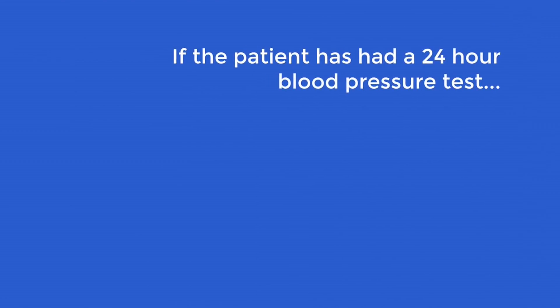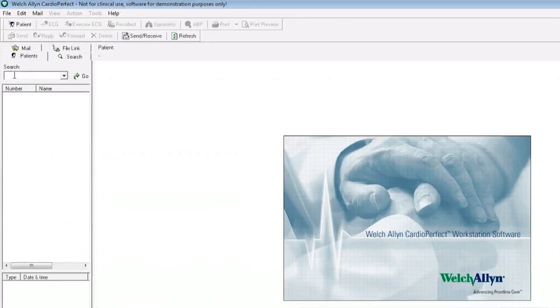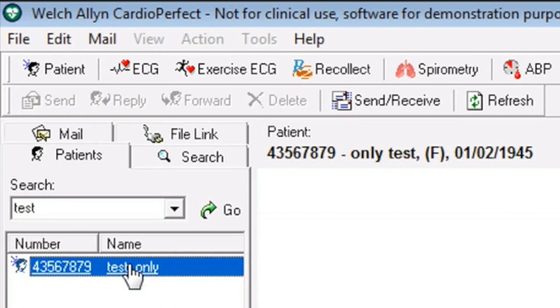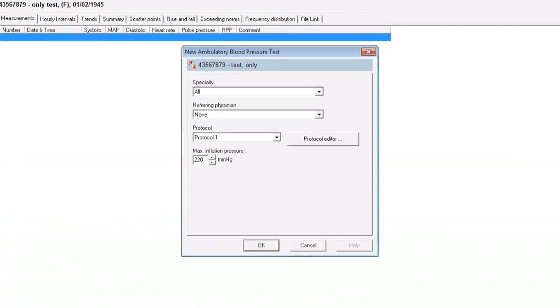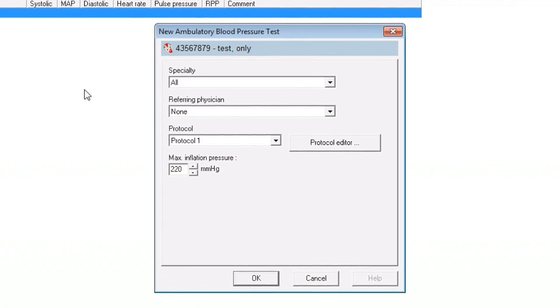If the patient has had a 24-hour blood pressure test before, their details can be found using the search function by inputting either their surname or patient ID number. When you have found the patient details, highlight their name then click on the ABP icon at the top of the screen. You will be prompted to select the device you are using for the test. The software will now communicate with the device and a box appears on screen which reads 'New ambulatory blood pressure test'. Within this box, select the desired protocol and click OK.